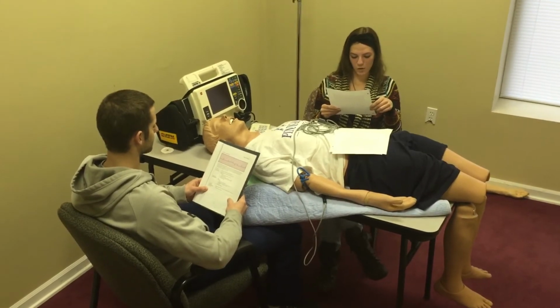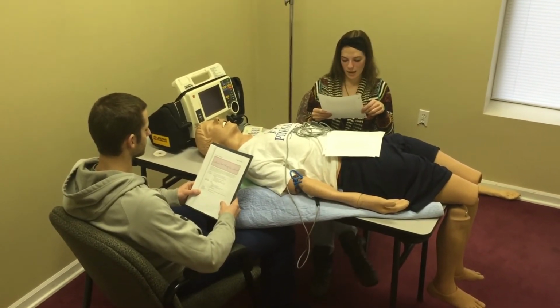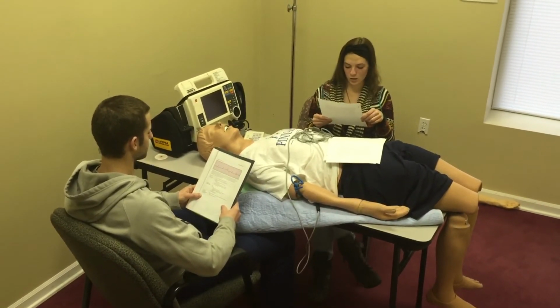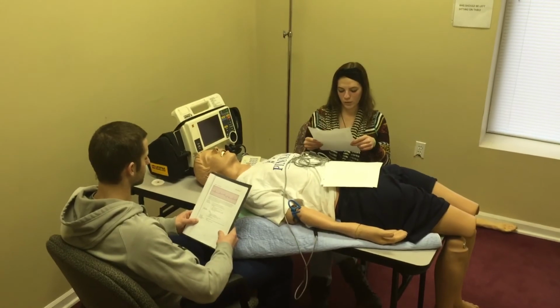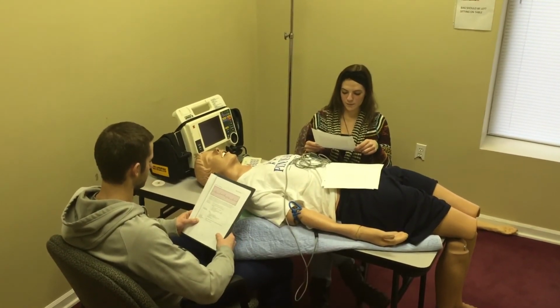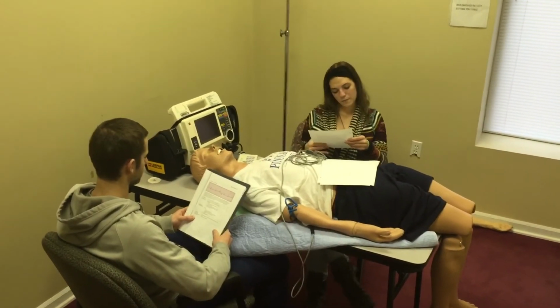His blood pressure is 140/70. Pulse rate corresponds to the EKG rhythm, 60 to 68 and irregular. The ectopy occurs approximately 8 times a minute. Respirations are 24 breaths per minute with normal tidal volume. So this is a normal sinus rhythm with PVCs. And he has cardiac chest pain.